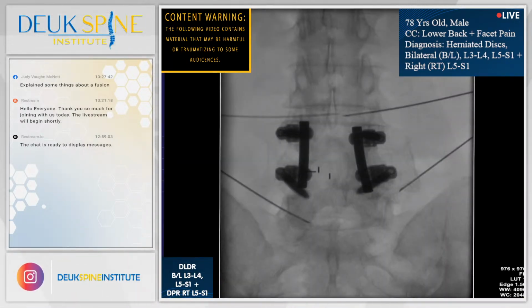And, oh, look at that. Or look at that. We'll just stay there for a second. Yeah, you can go back to that, but stay on that picture. Jordan, show us the massive fusion. It's called a bone mass or fusion mass. Look at this block of bone. This is normally not there. That was put there by the surgeon to get the bones to fuse together.